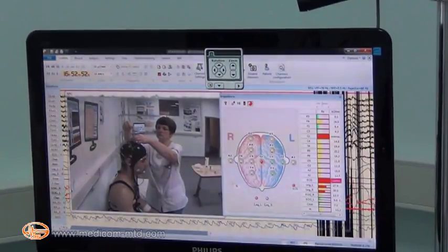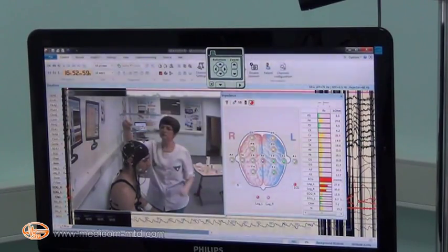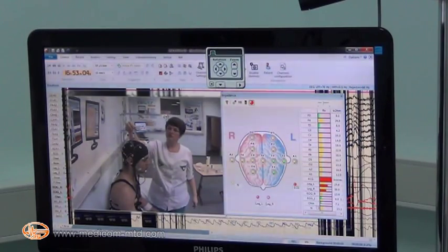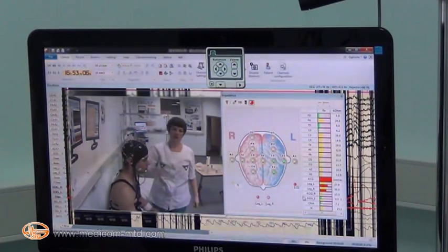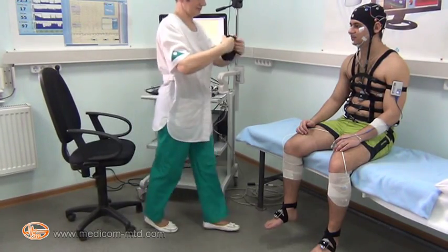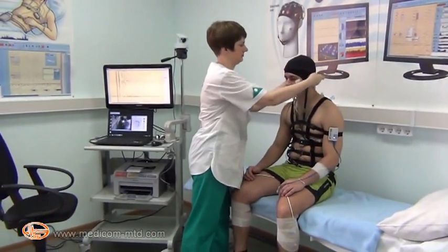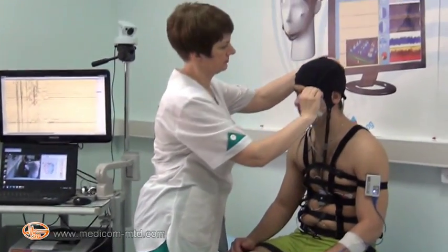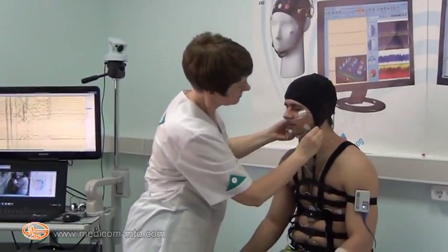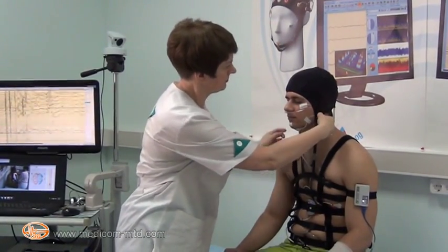In the impedance check window you can control electrode impedance. As the gel is inserted, impedance in the CZ derivation decreases. After filling all electrodes with gel and completing the impedance check, put on the covering cap, which ensures additional fixation of the electrodes and prevents gel from drying out during continuous studies.